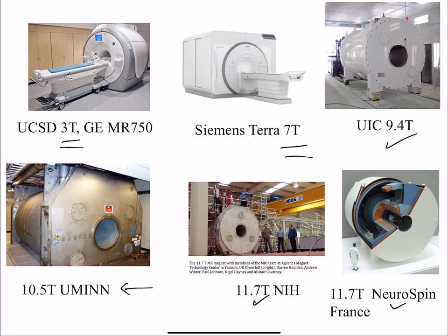Yes? So why is it that the high teslas don't work? Well, these MRI systems are amazing feats of engineering. Okay. So to have such a big field is not done very often. There's a lot of energy in that, and to get everything working is just not easy. So for example, this Neurospin in France, this was a project funded by the French government where they had all these atomic physicists who were out of jobs, right? So they needed a project for them.